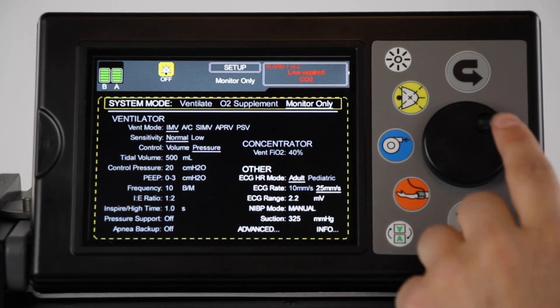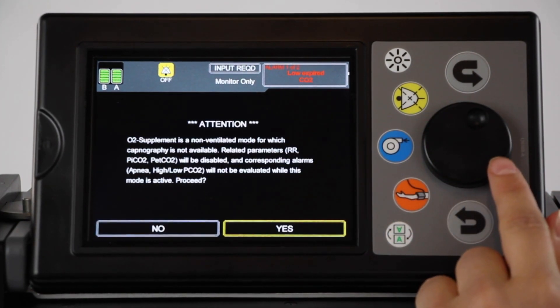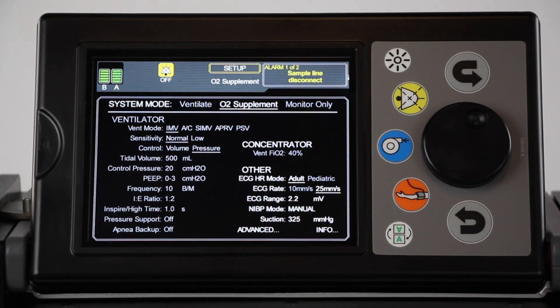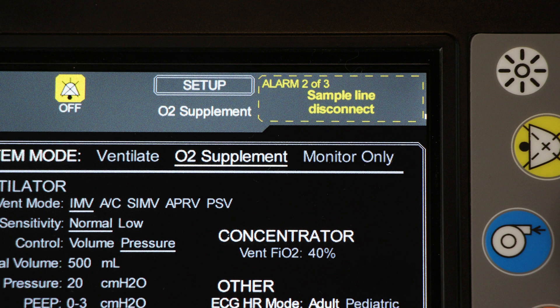On the setup screen, navigate to the System Mode area and set the mode to O2 Supplement. Select Yes to start the system running in O2 Supplement mode. Note that when MOVES SLC is running in O2 Supplement mode with no sample line to measure oxygen output, two alarms will be active: Low Inspired O2 and Sample Line Disconnect. This is normal and does not indicate a failure.